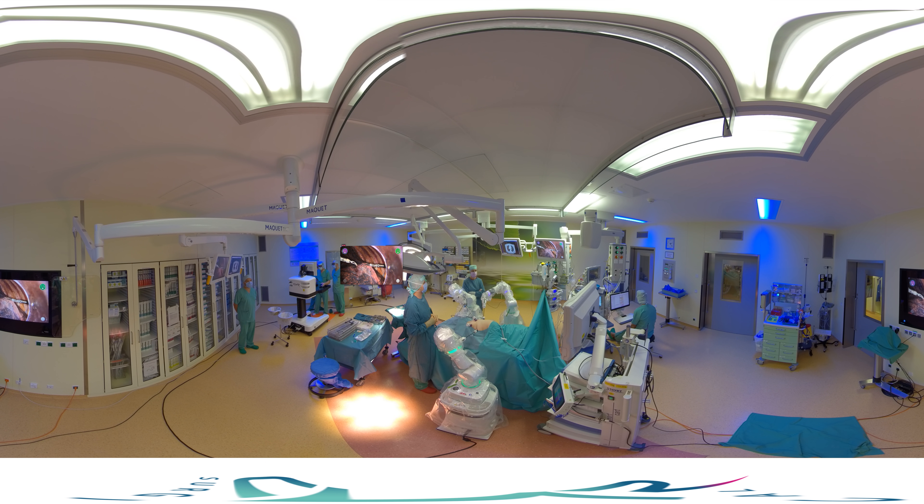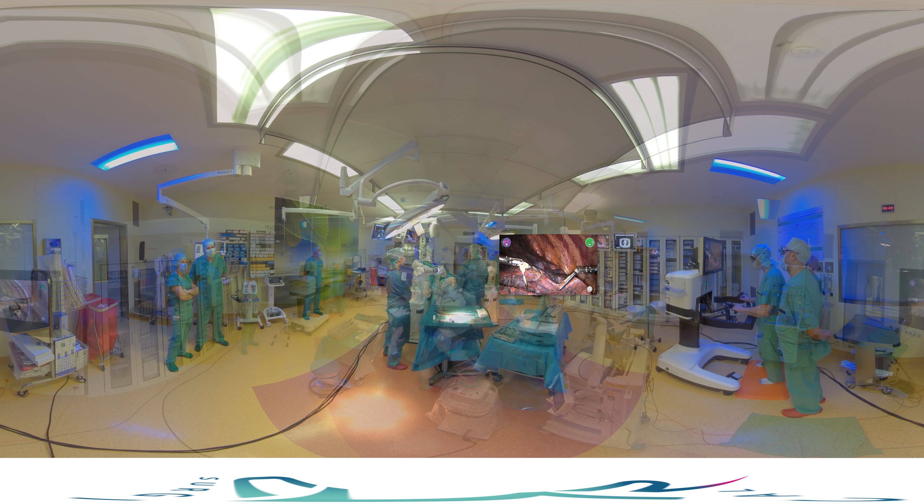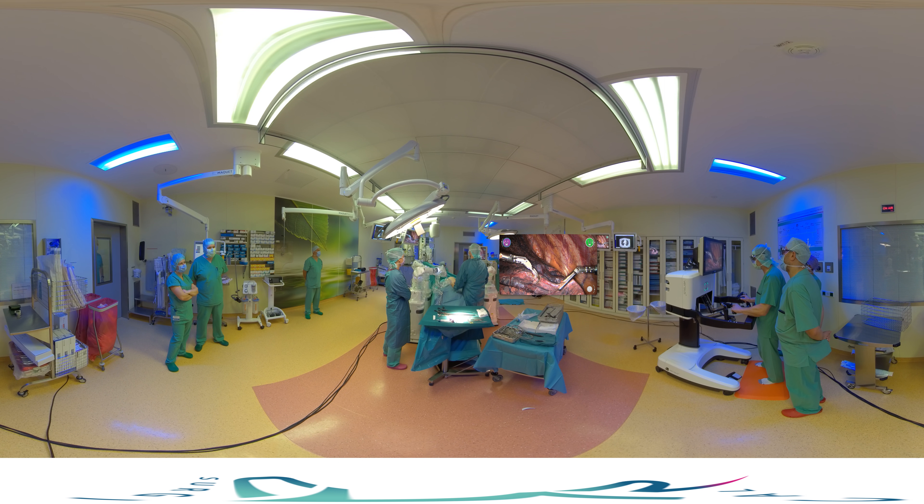As you can see from the virtual screen, for this procedure we are using a bipolar Maryland on our left arm and a fenestrated crossbar on the right hand. We are now starting the dissection.